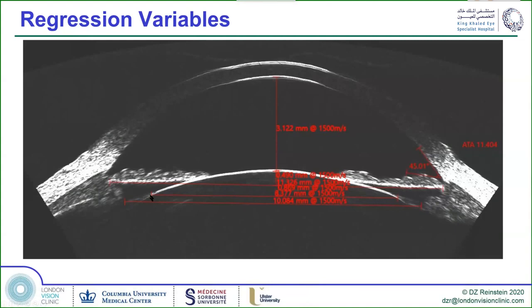And you can, for example, we said, let's measure, obviously we've got the white to white, we've got the ICL power because we've refracted the patient. We're trying to find the size. We know from just observing someone at the slit lamp that the pupil size affects the lens separation. So these are parameters that are for free. They're available straight away. You've got them there.